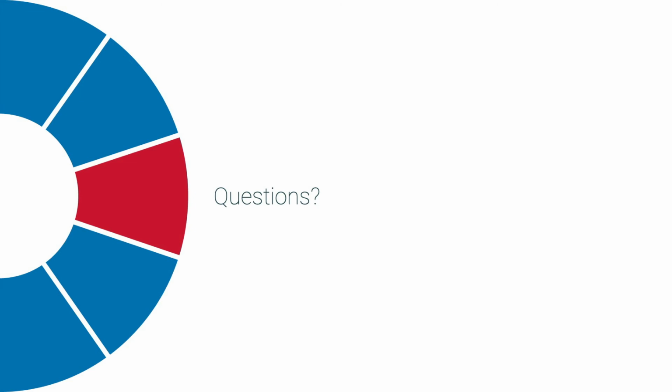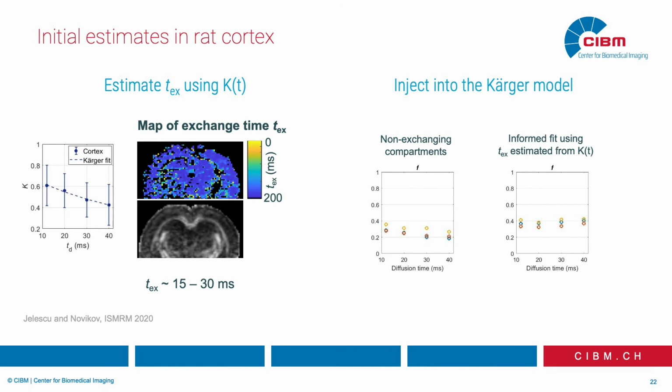Right. So for the first part, for the white matter model, it's definitely possible to do it on clinical scanners because, so for example, let's go back. The model I'm using here, even in the macaque, uses the same information that you need for DKI. So for a clinical in vivo, you can stop, for example, at B2000 or 2500 with 2 shells, and that's enough to derive all the white matter model parameters that I've explained earlier. So this is definitely not a problem.